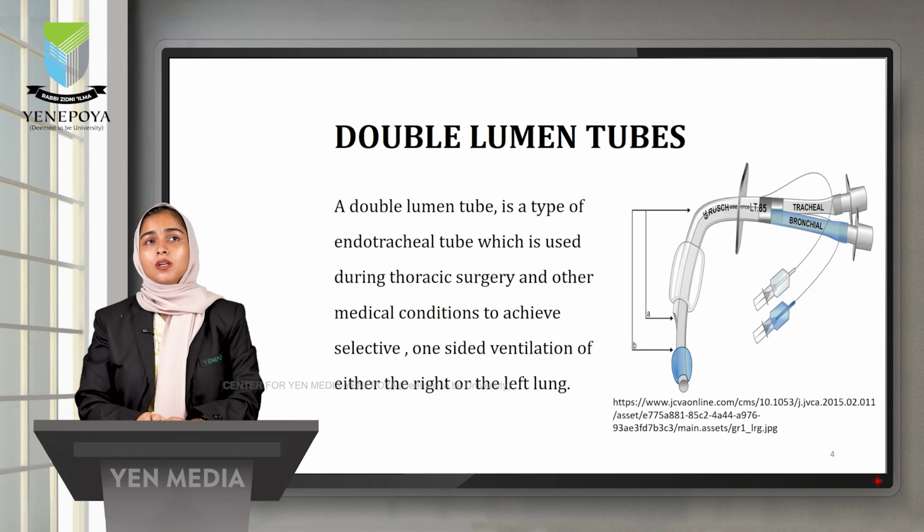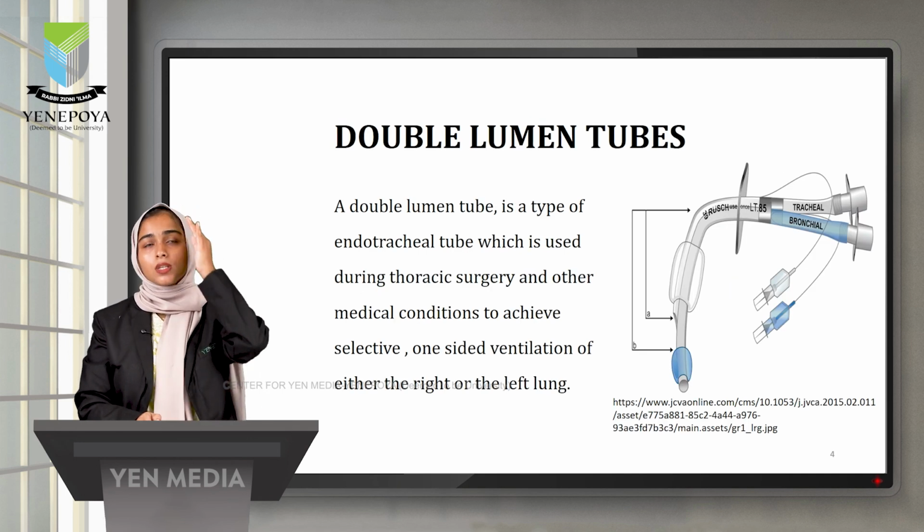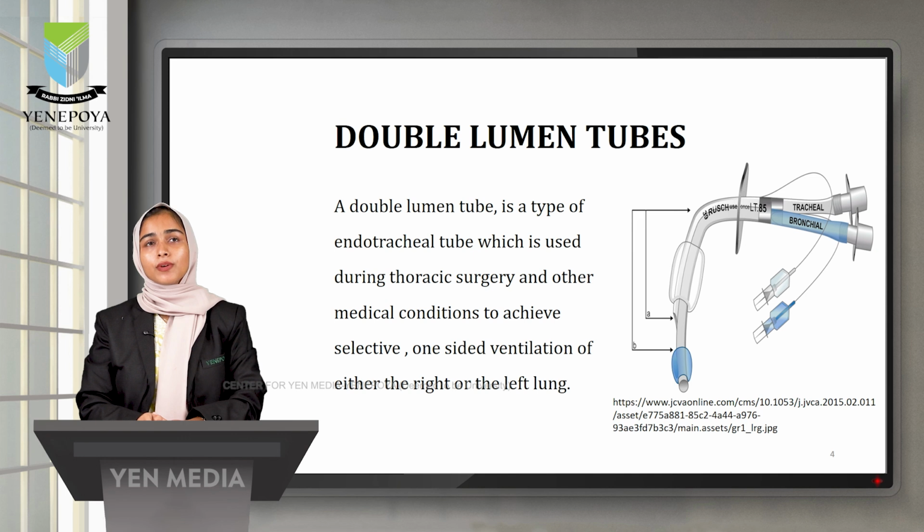Now we are moving to the definition of double lumen tube. The double lumen tube is a type of endotracheal tube which is used during thoracic surgery and other medical conditions to achieve selective, one-sided ventilation of either the right or left lung.